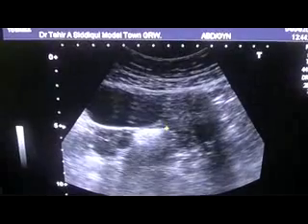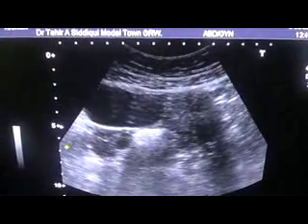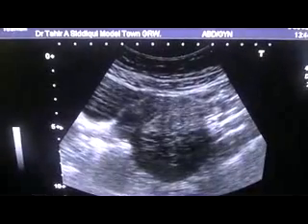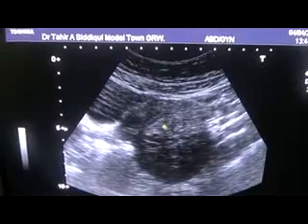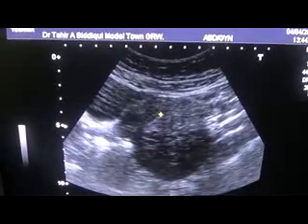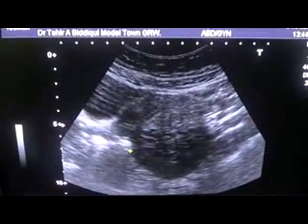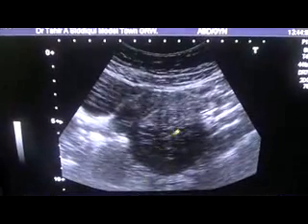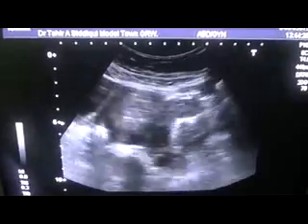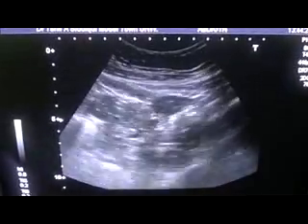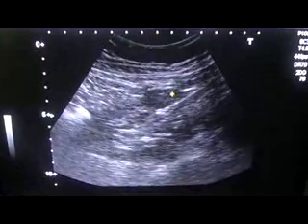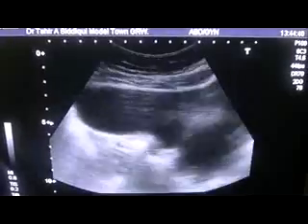This is the right ovary. You can see developing follicles. This is the transverse section of the uterus — anterior myometrium, posterior myometrium — and this is the myoma in this area. Solid, no posterior wall enhancement, no calcification, no solid element within it. Here I wish to show you the left ovary — this is the left ovary, with no follicular activity. So the dominant ovary is on the right side in this cycle of this young female.